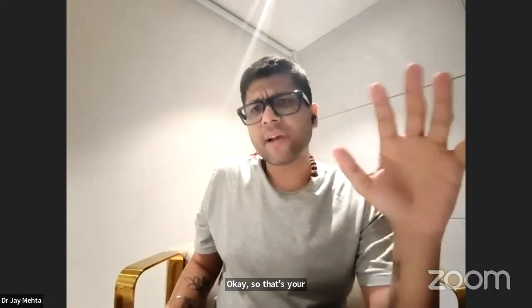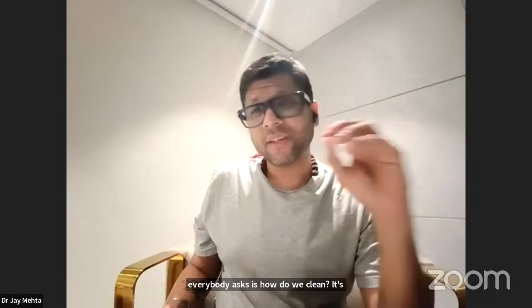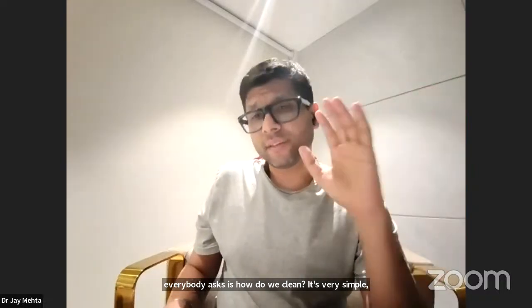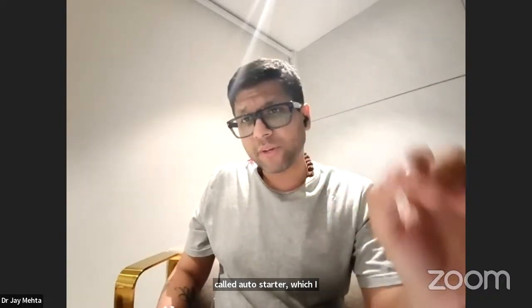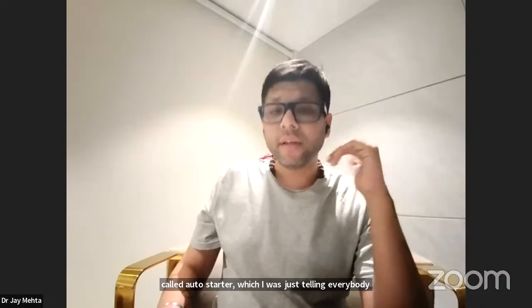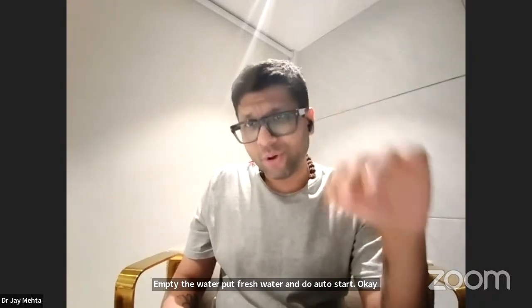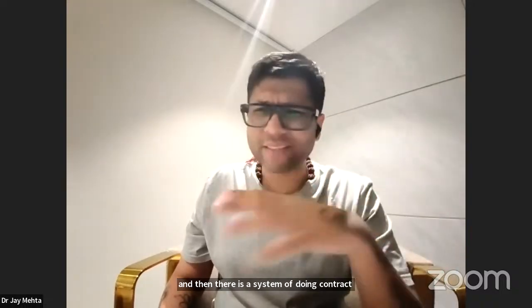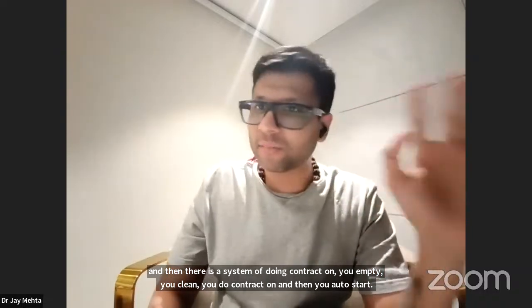Second question, which everybody asks, is how do we clean? It's very simple. Okay, the box type incubator has its own system of cleaning called auto start, which I was just telling everybody about. Empty the water, put fresh water, and do auto start. Okay, and then there is a system of doing contracon. You empty, you clean, you do contracon, and then you auto start. It's a very standard thing. Nobody needs to listen to me. It is just the instruction on the machine.